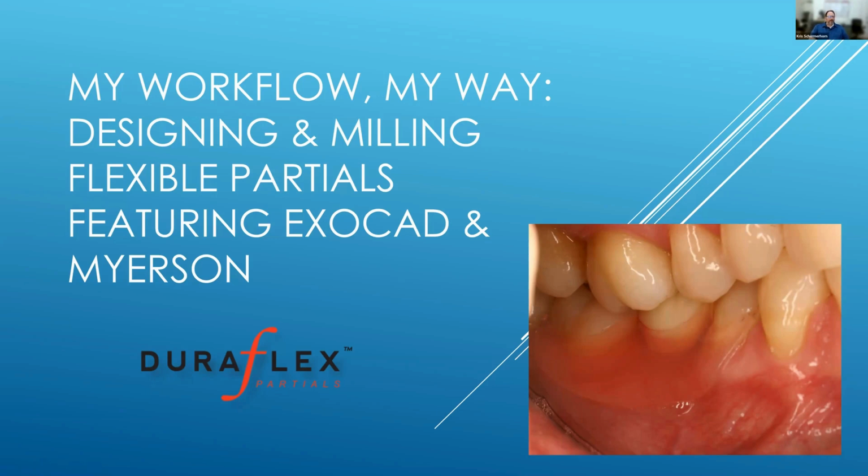The specific material that I'm going to talk about, because it's what I'm most familiar with, is Myerson's DuraFlex. DuraFlex is a flexible partial material, very similar in look and feel to a Valplast or a TCS style or type of material, but DuraFlex is different. DuraFlex is a semi-crystalline thermoplastic. It is going to have a lot of flexibility to it. The nice thing about DuraFlex is it's a polypropylene. It's not a nylon, which a lot of the other materials in the industry are.